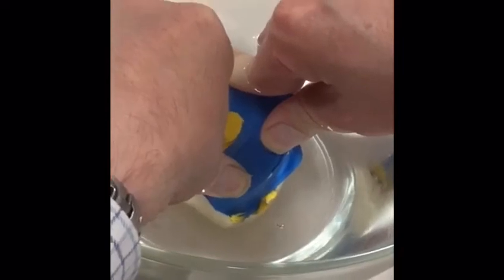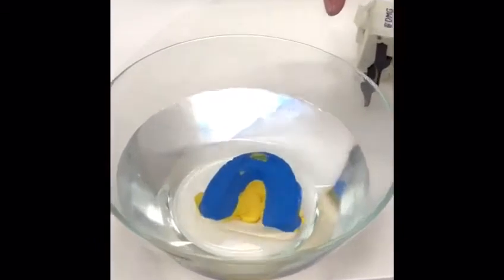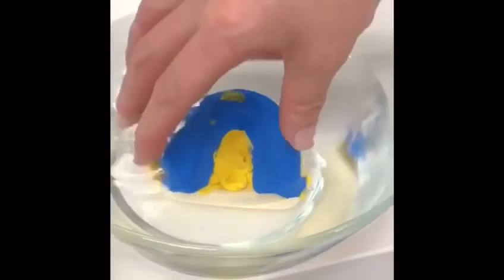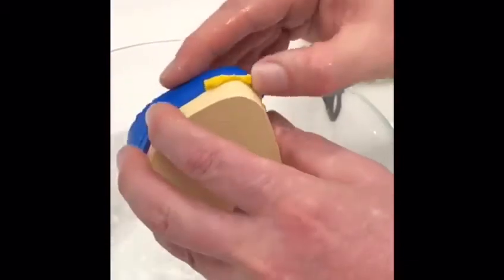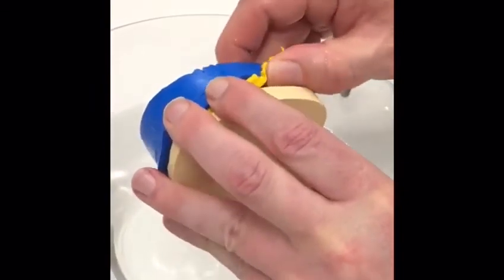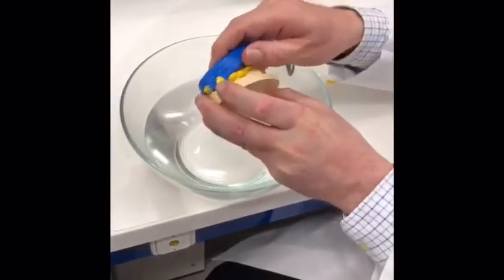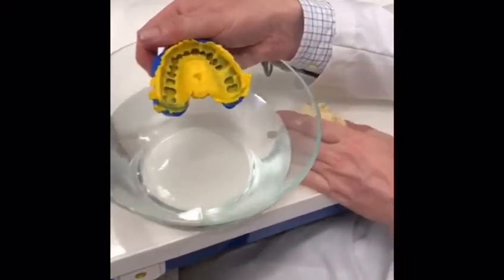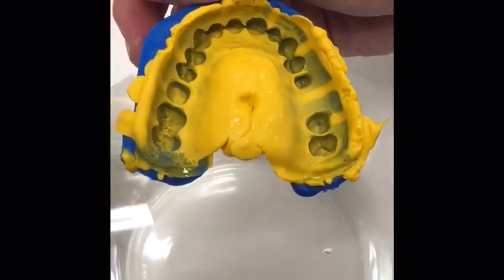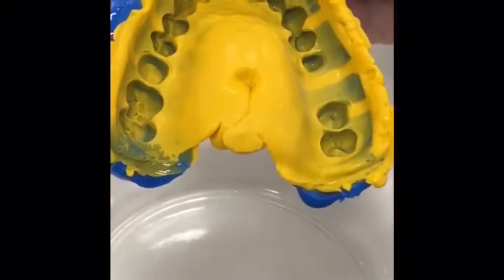Now we have to wait the full time — roughly six minutes. Moment of truth. Okay, I'll take it out, peel it off. This is the reason I don't want the tray on, because it's really difficult otherwise. And look at that — it's a great impression. Very equal distribution, very thin film. Nothing to complain about.